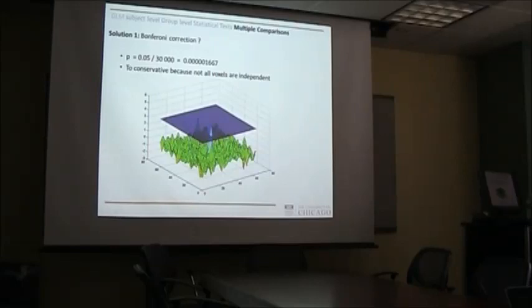So what this shows is that there's a certain smoothness of your data, right? If this little voxel has a high t-value, its neighboring voxels are more likely to also have a high t-value, right? The reason this is the case is partly due to one of the pre-processing steps, if you recall from last week, where you actually smooth your data. So you're trying to spread it out, to make sure that your data is correlated a bit.